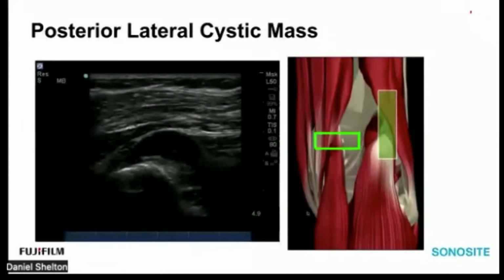All right, so incidentally over here laterally, what do we call a structure that does not protrude between the medial head of the gastrocnemius and the semimembranosus bursa? If it's lateral in nature, it's considered a ganglion cyst or a posterior lateral meniscal cyst. So it's not classified necessarily as a true Baker cyst because a true Baker cyst does need to protrude between these two structures. If it's lateral or anywhere else out here, you can just classify it as a posterior cyst, ganglion cyst typically, or if you do chase the little comma-shaped cystic structure down to the meniscus, then you could make that call.